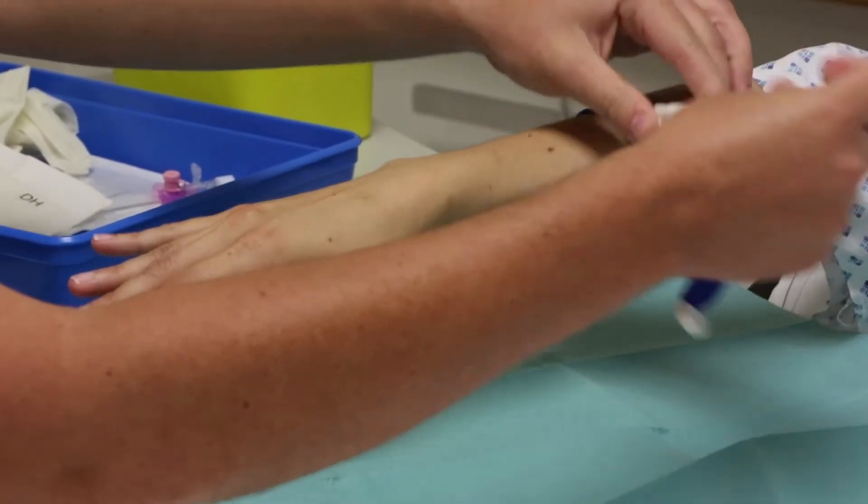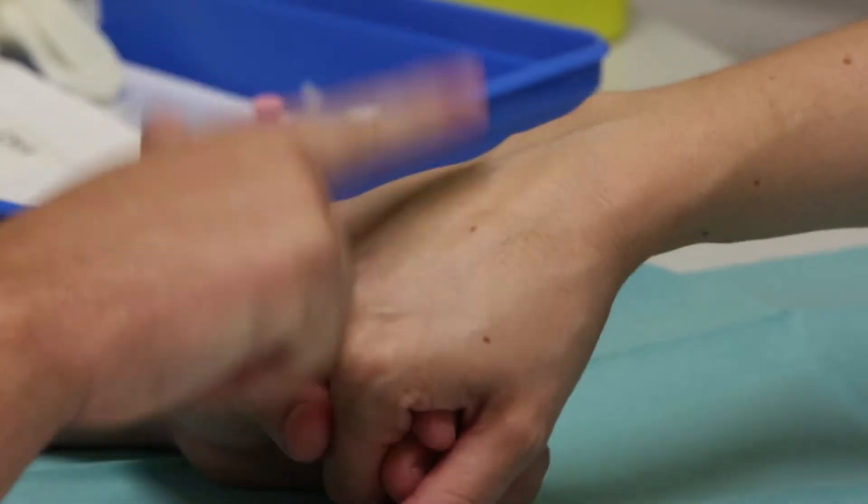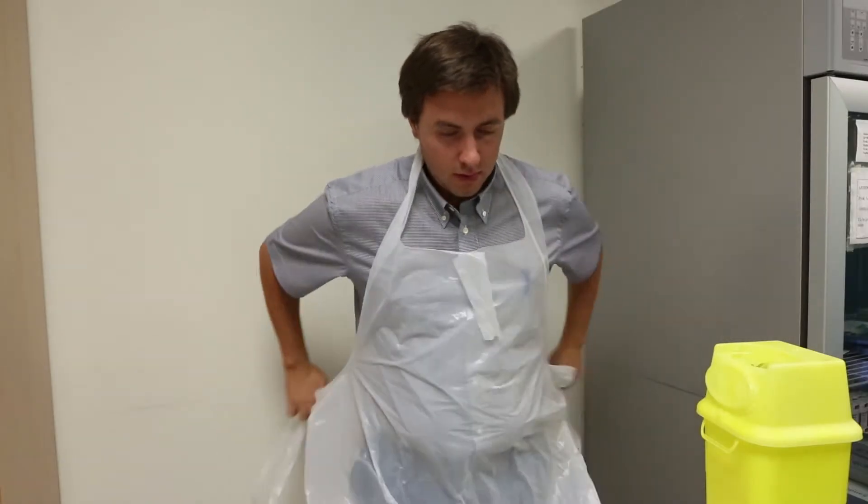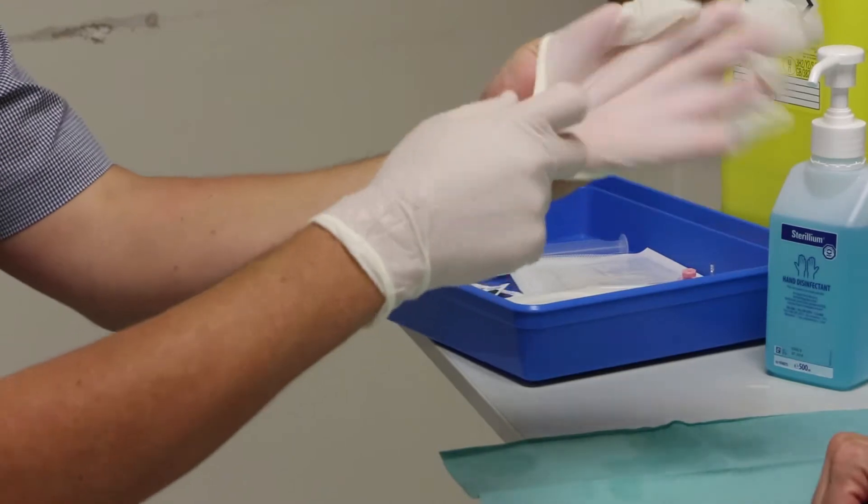Step 7. Apply the tourniquet and locate a vein. Step 8. Put on an apron, apply alcohol hand rub and wear non-sterile gloves.